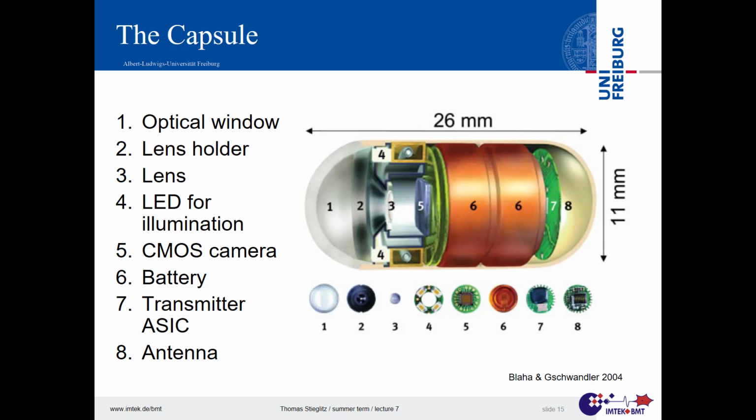And somebody had to assemble that. And that means you can already identify those modules here, the LEDs with 4 around the ring. This is all not rocket science from the single component, but it's a clever idea and very good engineering to get things together in such a modular system that they stick together. To find out, well, what is a clever interconnection concept that I have to bring everything together, that it stays in place, and what do I use for closing the capsule in a way that it doesn't get too hot.